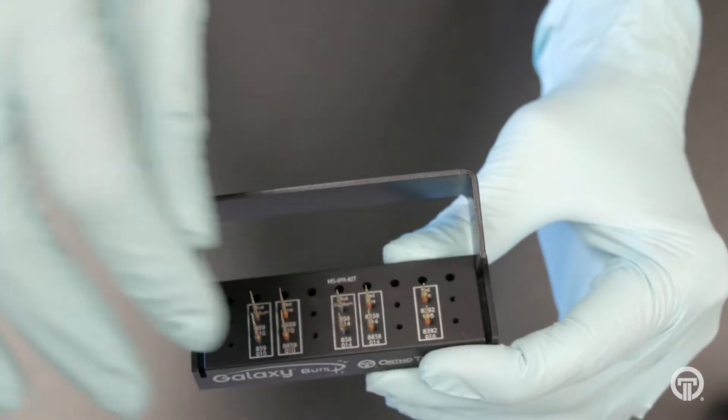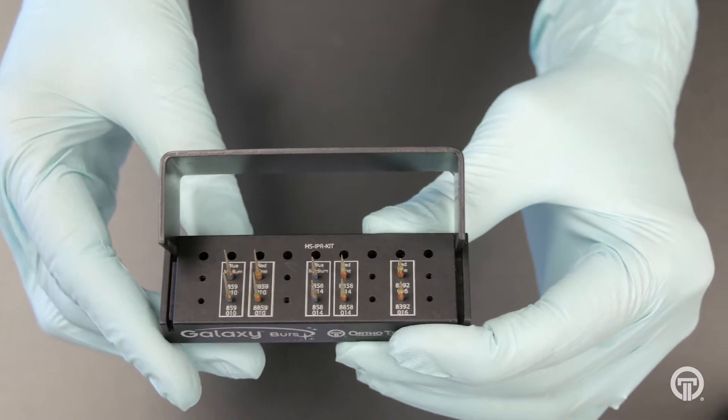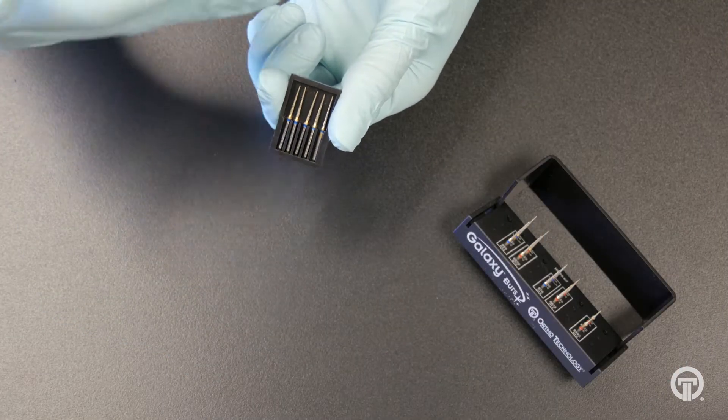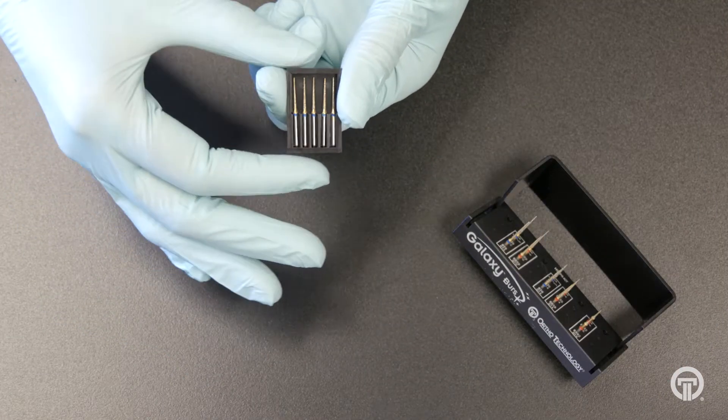They are for use with the high-speed handpiece. It is recommended to start with a medium diamond to remove the bulk of the enamel, while following up with a fine burr to smooth the tooth surface.